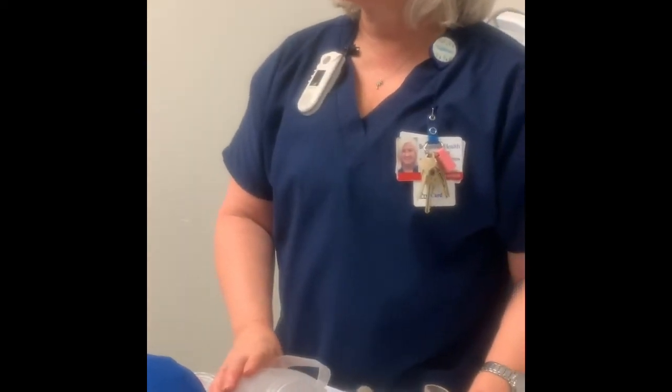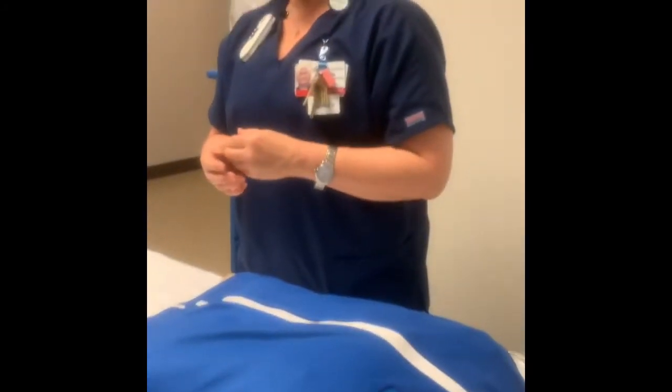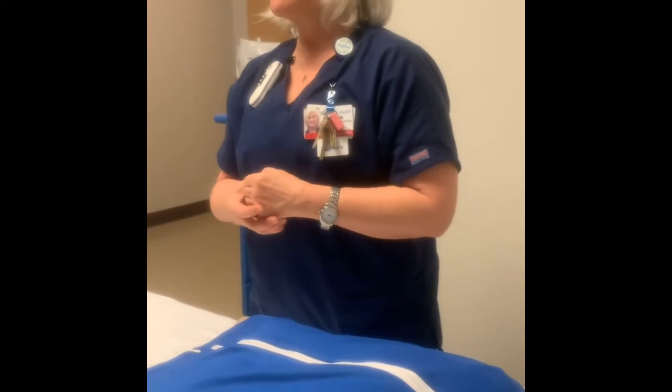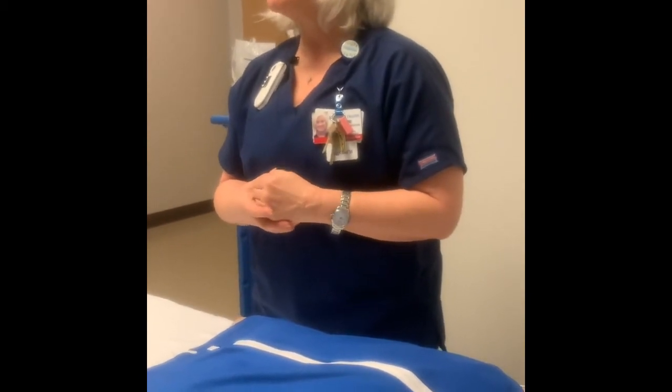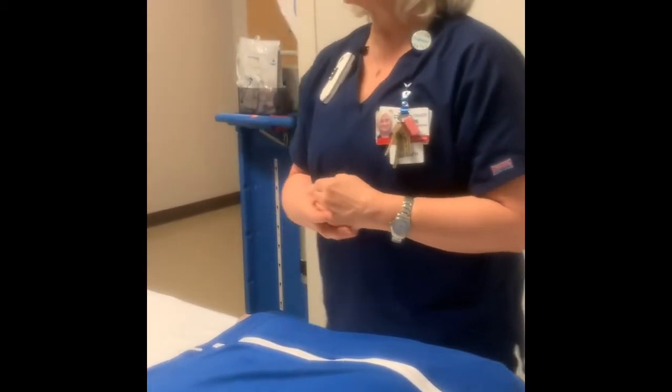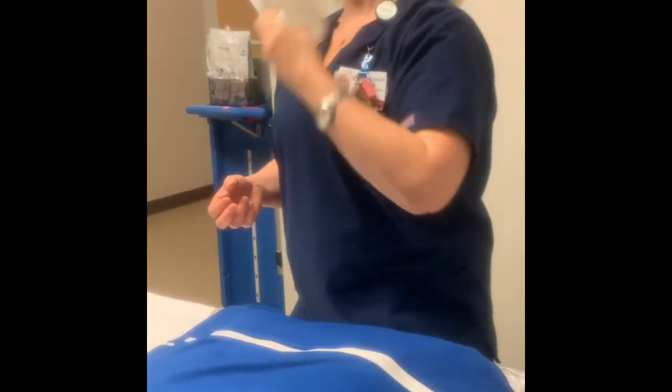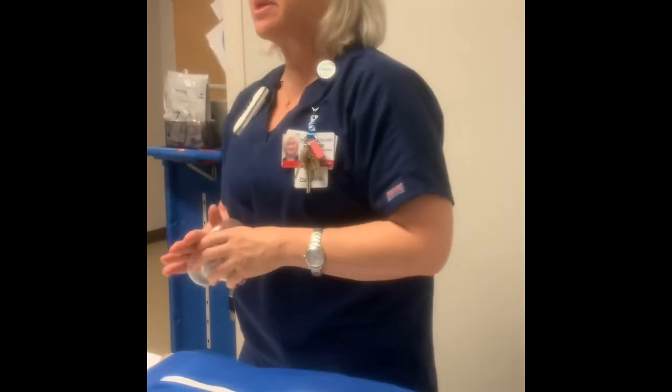So if we don't have a pediatric one, since we don't do peds over here, what do we use? You always have to use the peds one here. It used to be that all the ambu bags had both in there. They used to. I don't know if that's true anymore. Yeah, I think they took those out. Okay. So I think we need to get one over here, because you have to get a pediatric one. You can't use an adult. If you try to use an adult on me, there's just no way you're gonna get a good seal. So you gotta have a pediatric.